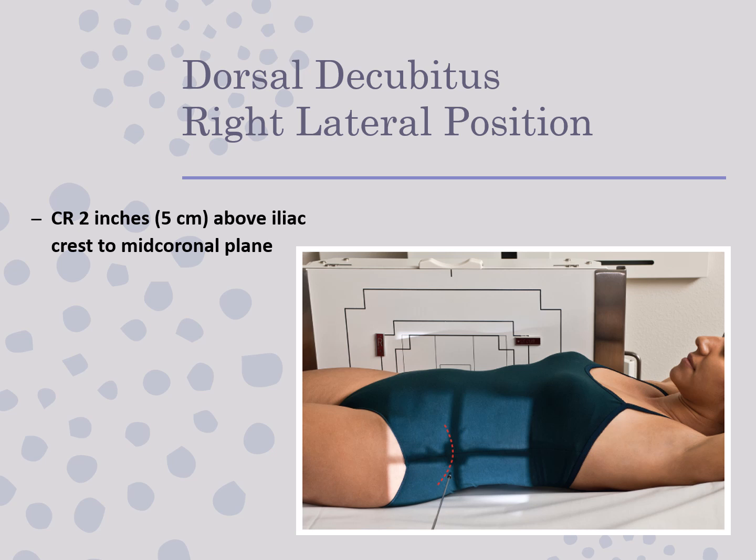This would also show any abnormal masses or air-fluid levels, but a lot of times with this, they're looking for aneurysms. An aneurysm a lot of times can be seen, like an aortic aneurysm. You could see that sometimes on a lateral lumbar spine, because a lot of times patients will come in complaining of low back pain, and when we do the lumbar spine imaging, you can actually see sometimes the aneurysm. So then they may order a dorsal decubitus to follow up with that.